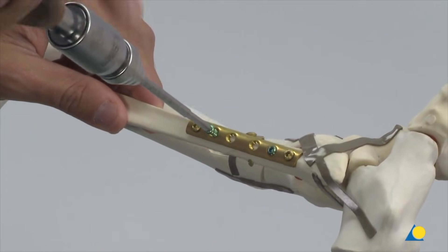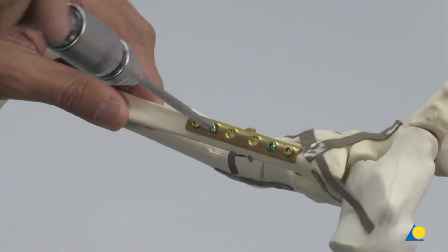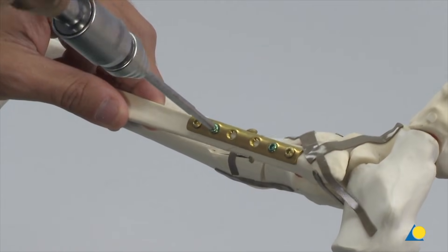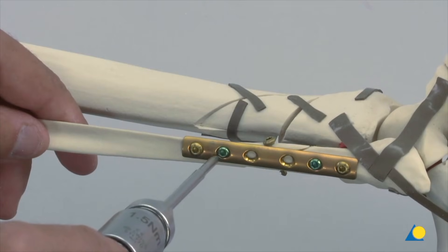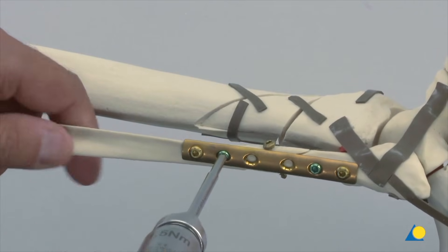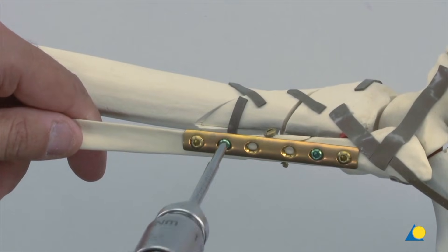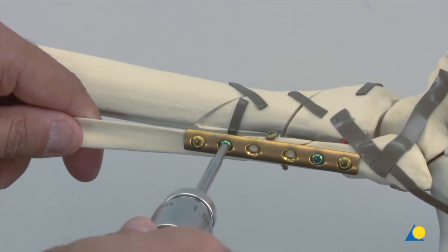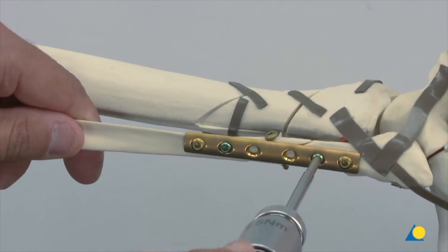If the bone is very osteoporotic, two locking screws might not be sufficient, and the cortex screws should be replaced by locking screws. Final tightening is done manually with the torque limiting screwdriver to prevent any over-tightening or jamming of the screw. An audible click indicates that the limit of the torque has been reached.